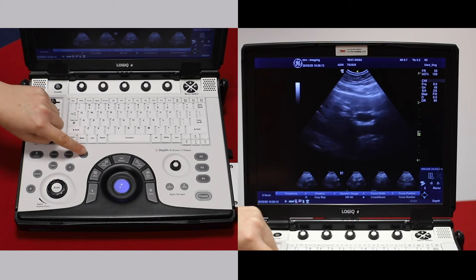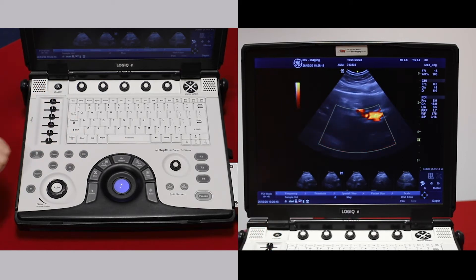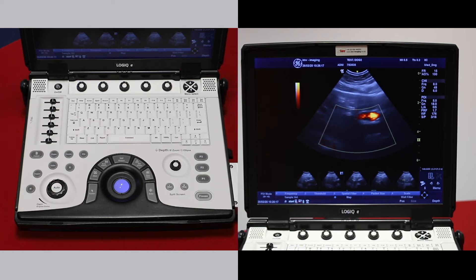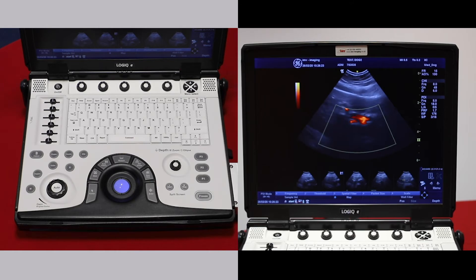PDI is your power Doppler. This gives you presence or absence of blood flow, but it does not give you direction. It's also very good in the abdomen because it's good at picking up very low velocity flow.